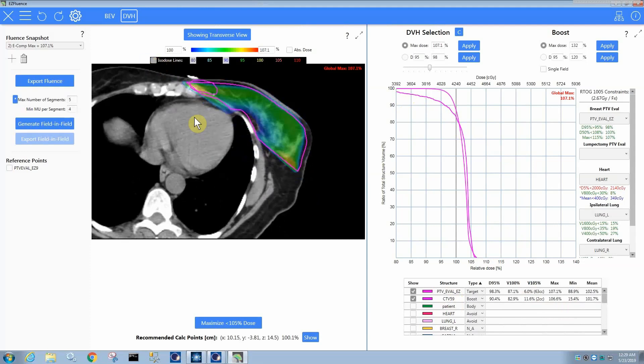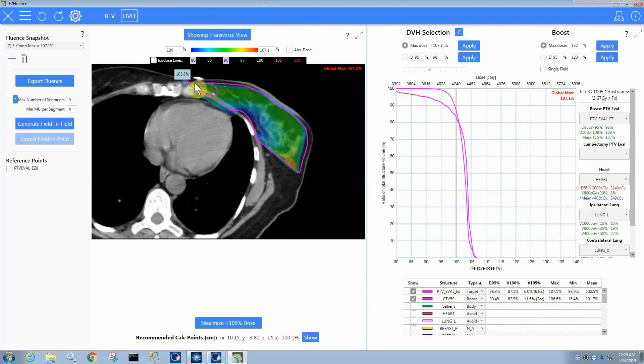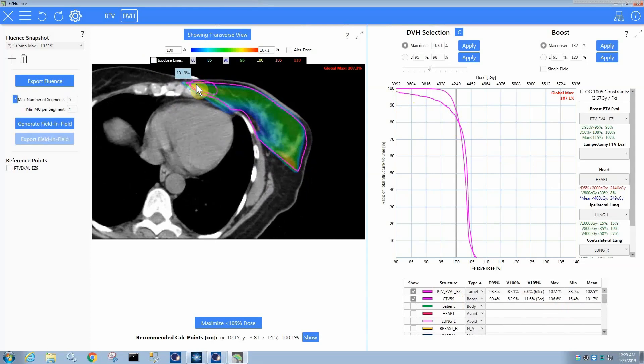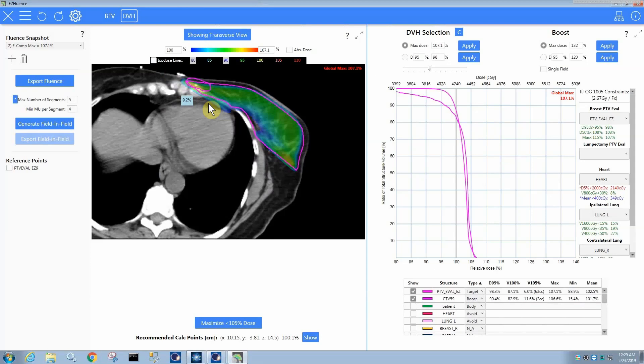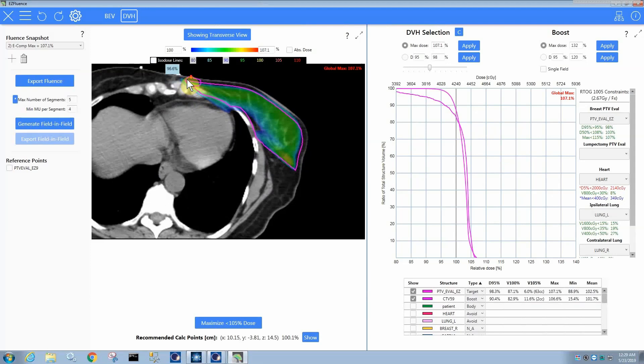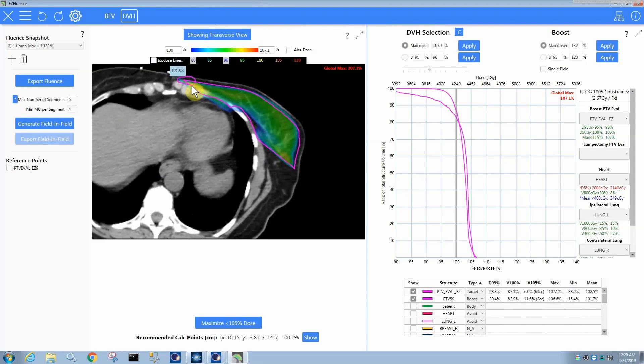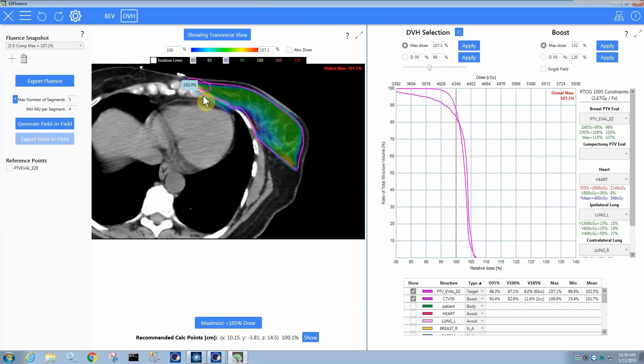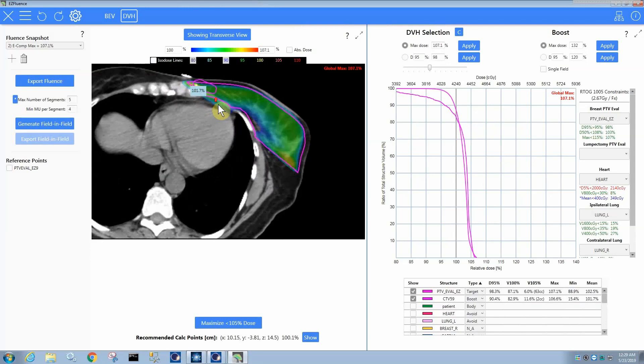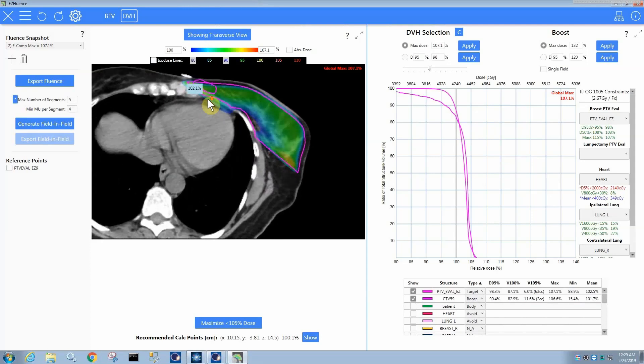Let me turn the isodose lines off. So it's been contoured in a way where there's a decent chunk of the structure that's outside of the PTV eval structure, which means it's closer than 5mm to the skin. So, obviously, if you have a structure like this and you're trying to get full coverage, the physics just makes it impossible.